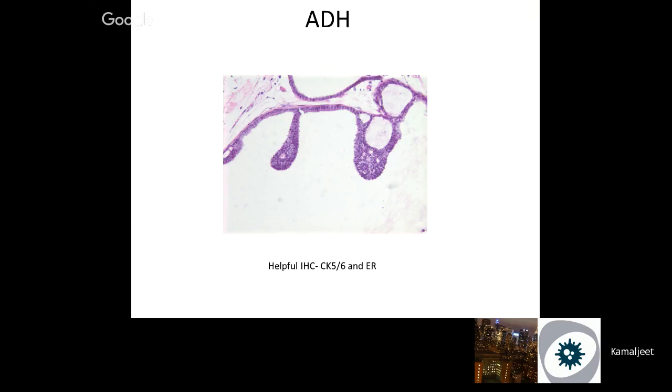There are a bunch of patterns you can see in ADH. One of them is micropapillary, which in this picture is very obvious, or overt, but it can be subtle, like what you see in gynecomastoid, and we will look at the picture later. In a micropapillary architecture, you want to see a narrow base, like a club shape, and the size of the nuclei at the top is almost the same as at the bottom. That would make it micropapillary type ADH.